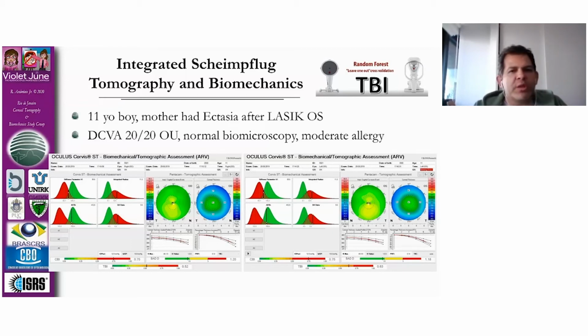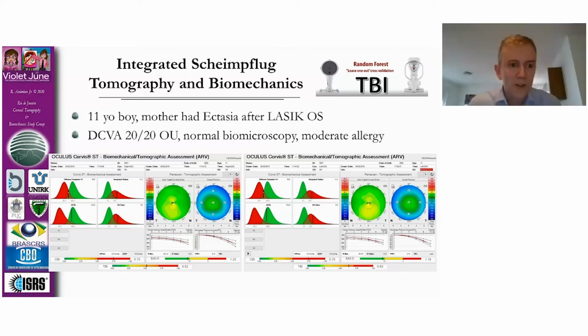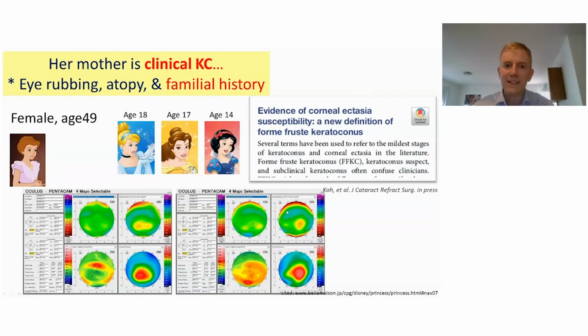We want to treat large numbers of populations because that's our work. We want to help all the patients. But for every case, we have to sit and look at the patient's eye and take emotional intelligence into the equation, to use the advantage of the artificial intelligence that will help us make a decision for the patient. And that's very important. Shizuka also sent some more interesting cases related to family history. And perhaps Shizuka, you can present this case.